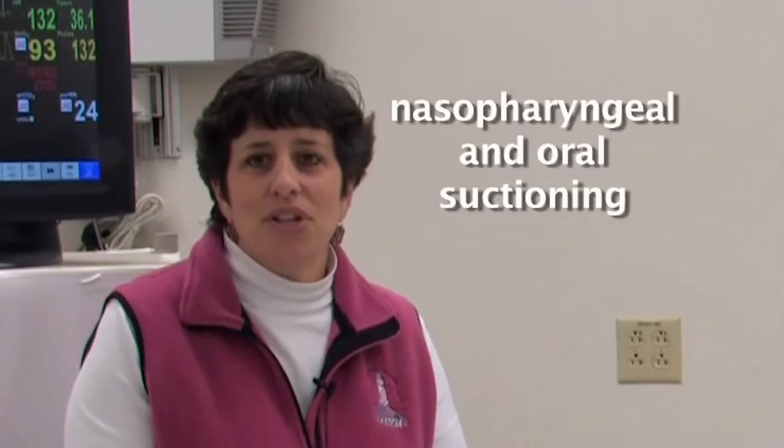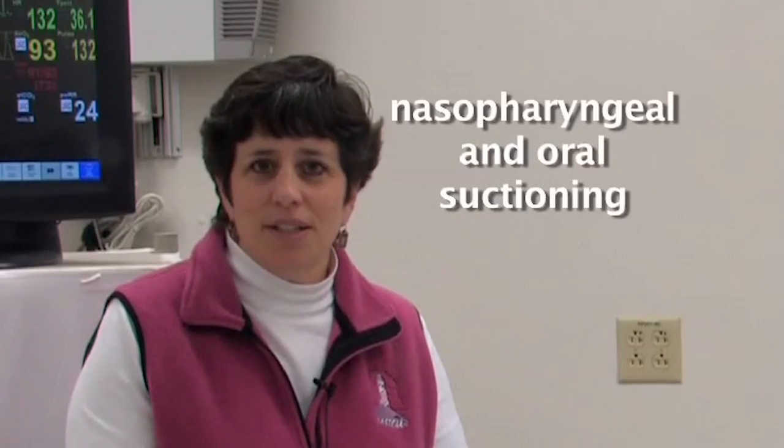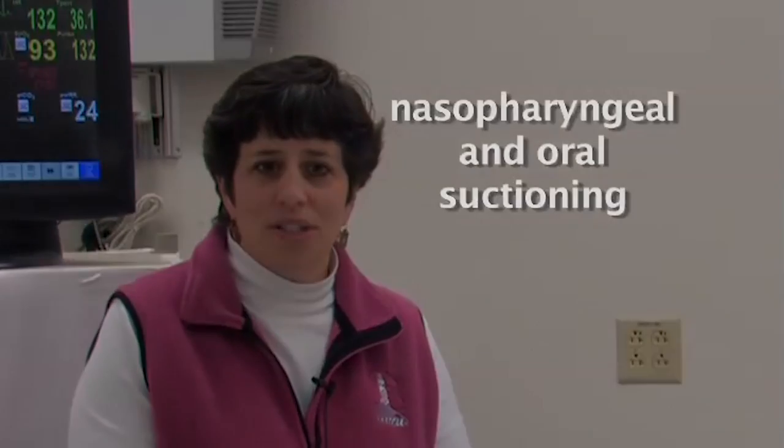Hi, my name is Sue Hamilton. I'm a nurse educator at Children's Hospital Boston. Today I'm here to talk to you about nasopharyngeal and oral suction in the non-intubated patient.